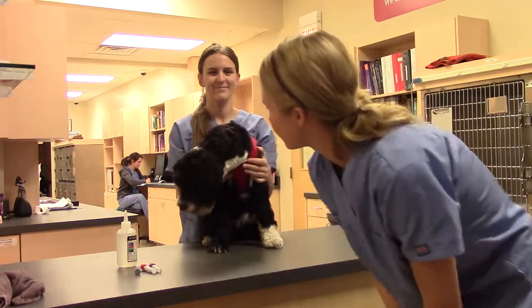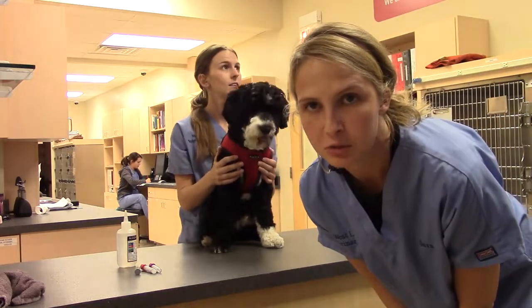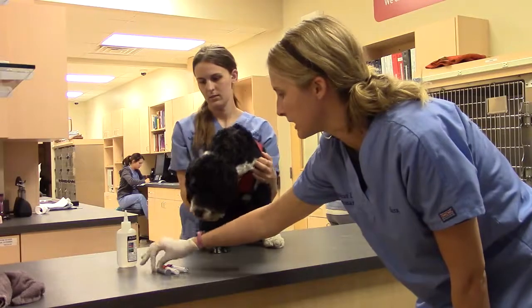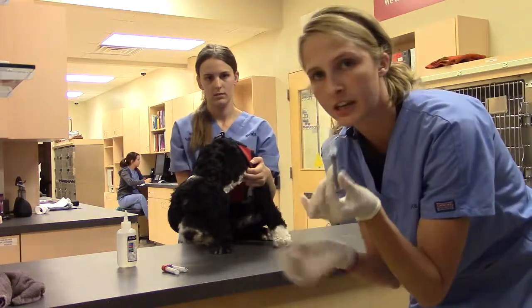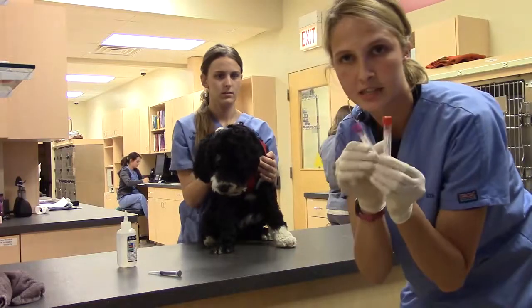Hi, this is Sarah Levine. We are about to do a jugular draw on Miss Clementine. This is for Vet220. I've got my supplies over here: alcohol, a needle — I've gone with a 22 gauge and a 3cc syringe — and then we've got our blood tubes as well.